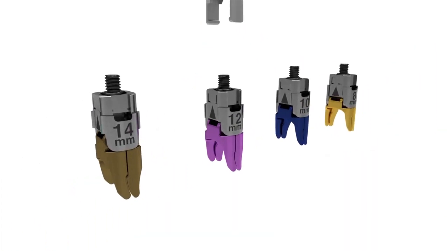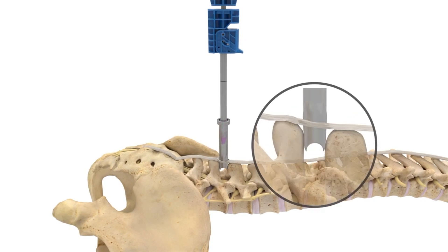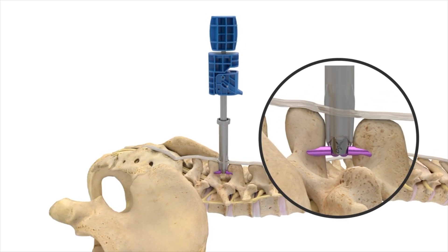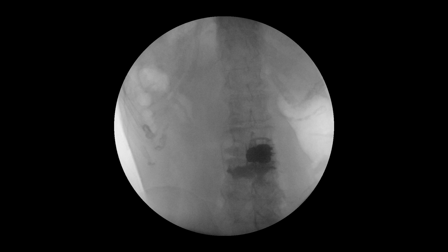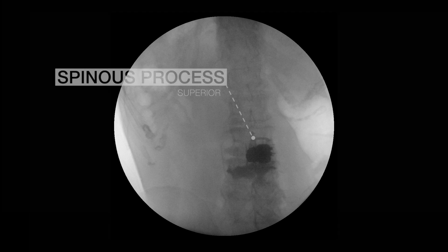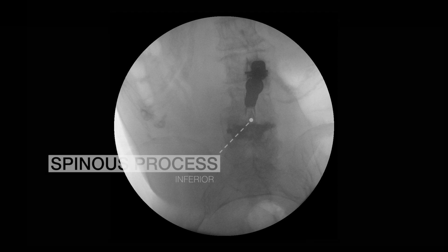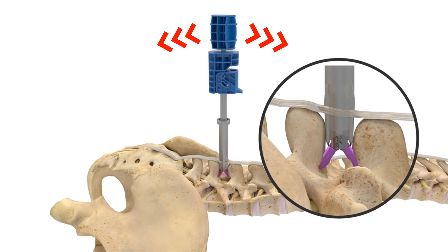The appropriately sized implant is then loaded onto the inserter and the driver is inserted through the proximal entry point. The implant is then deployed with clockwise rotation of the driver. When the implant is deployed about 30%, AP fluoroscopy should be used to confirm bilateral containment of the superior and inferior spinous processes. A caudal and cephalad tilt of the fluoroscope may be necessary to visualize this. After confirmation, the driver is rotated clockwise to completely deploy the implant. A rocking sagittal motion can be helpful with deployment. Care must be taken to maintain a strict sagittal motion with the rocking to minimize lateral deviation.